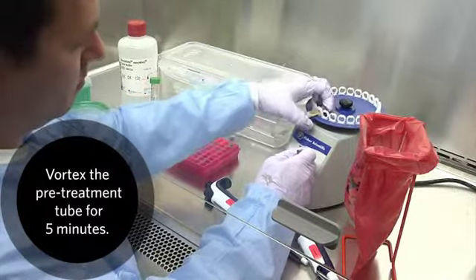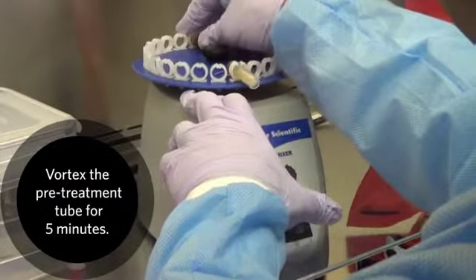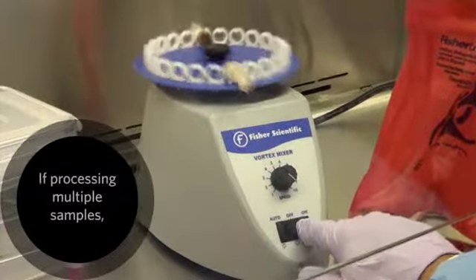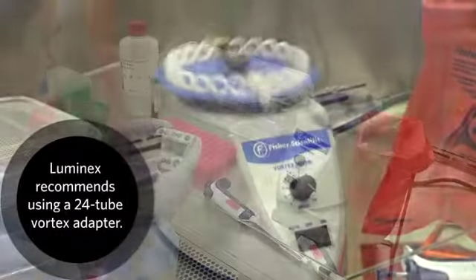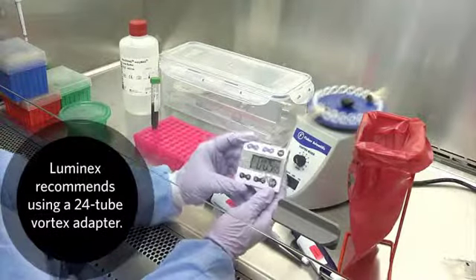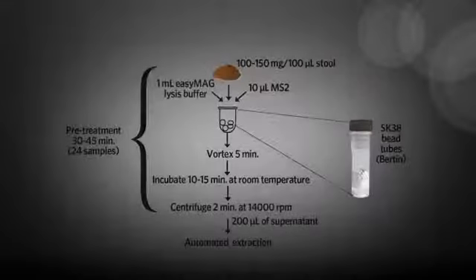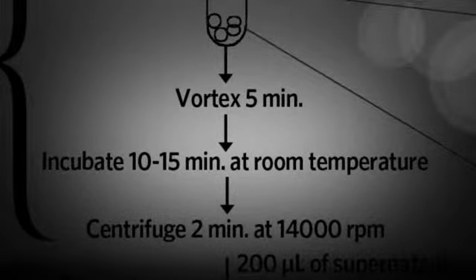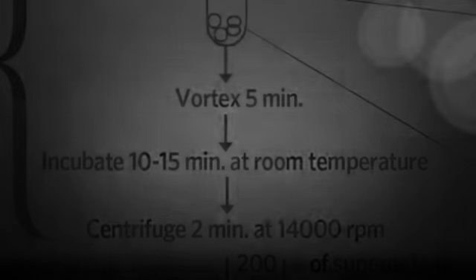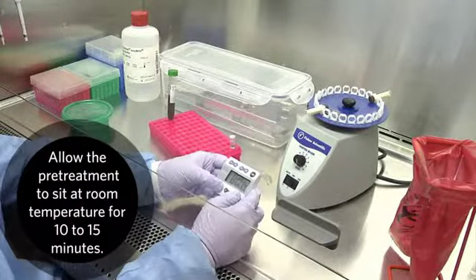Vortex the pretreatment tube containing lysis buffer, sample, and xTAG MS2 for 5 minutes. If processing multiple samples, Luminex recommends using a 24-tube vortex adapter. Allow the pretreatment to sit at room temperature for 10 to 15 minutes.